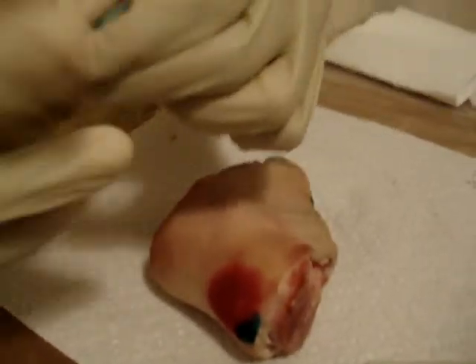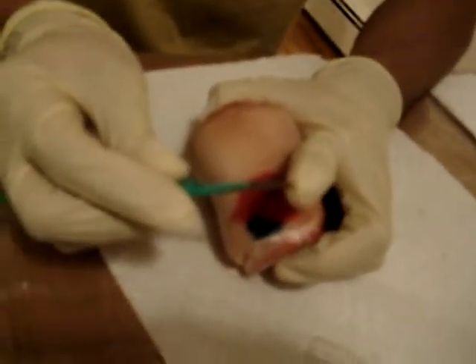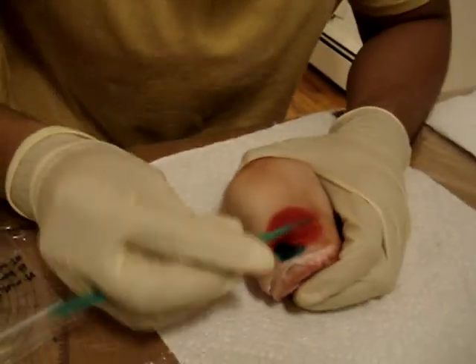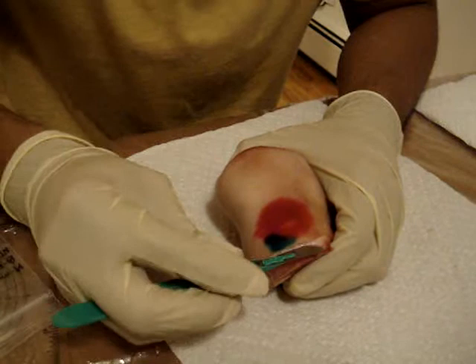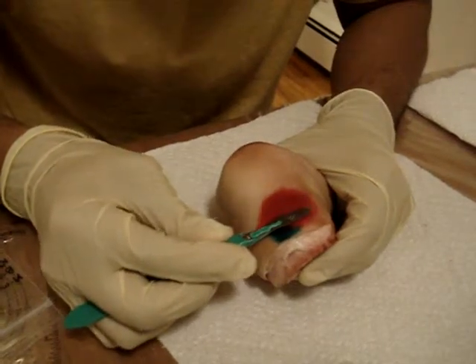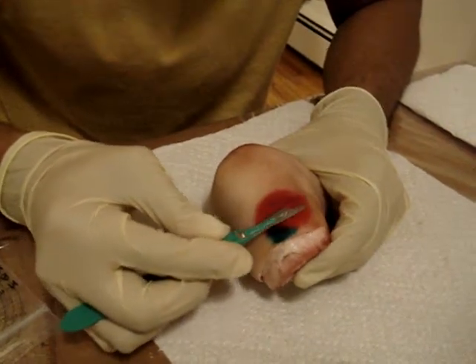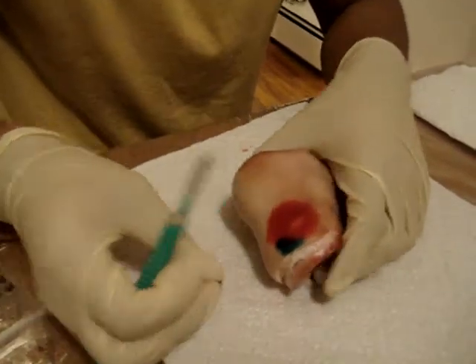So we have to keep on continuing the shaving part. Again, angulating. Make sure that the tip is not pointing to the skin of the patient. So, and our forearm is well rested on the edge of the table. Again, we hold it on the third web space, stabilize, firmly holding it on the serrated part of the scalpel, and then angulating it a little, and then doing saw-like fine motions which are coming from the fingers and the wrist. Alright, okay. We see our second shaving here.